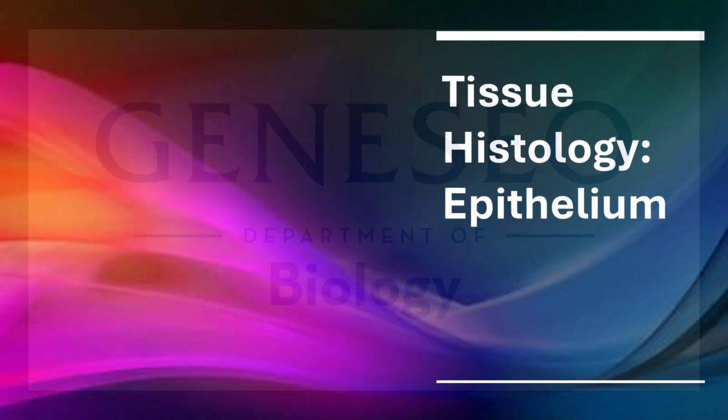Hello A&P students, this is Mr. Becker here to discuss the basics of our first class of tissues in the histology lab, epithelium. We'll cover the basic characteristics of epithelial tissue and then cover the major types of epithelium that can show up on the histology practical.